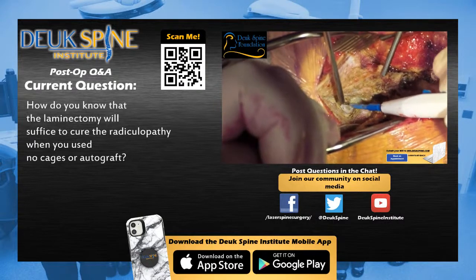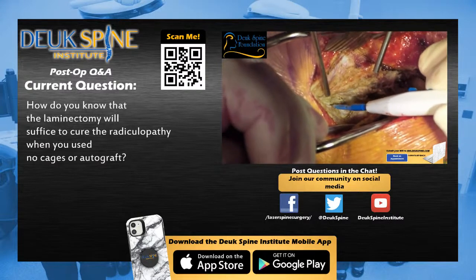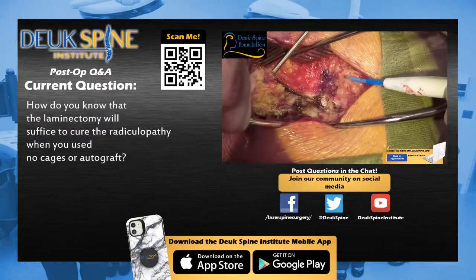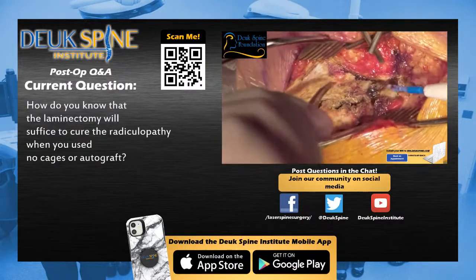I could feel the foramen when I put the Kerrison in there. That was the tool I used to remove the ligament. Kerrison punch is what it's called. So I could feel with the footplate that the nerve root was decompressed after I took those bites of the foramen out from the back.